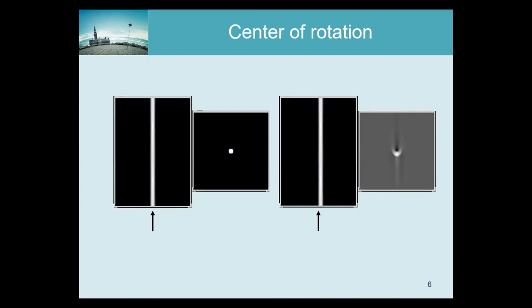180 degrees. If you then look at the heart, you see effects like that, where the apex has been deformed and you see negatives and positives. But if you acquire over 360 degrees, then you don't see that effect. The effect is then just simply blurring. And you can imagine that if you would scan over 360 degrees, you would get another contribution similar to this, but flipped vertically. And if you add those, then you will get a simply blurred image.